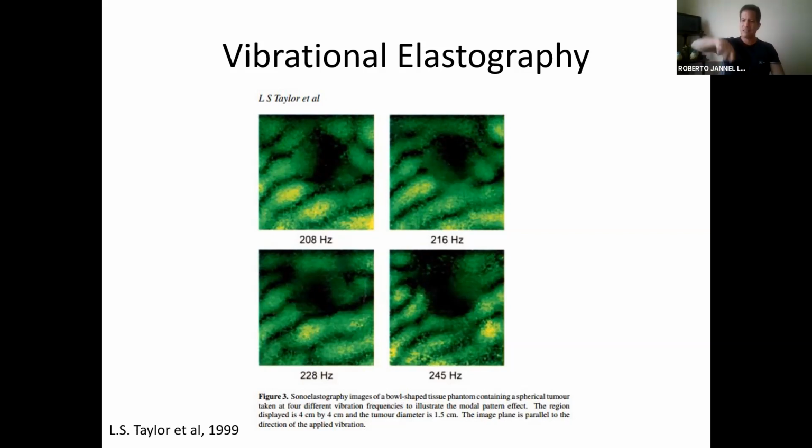If you're receiving the signal and measuring not the speed at which things are moving, because you kind of know that, but the magnitude of how much they're moving, then you can determine which tissues are stiffer and which are softer. You do that with a method called power Doppler. Again, look it up in your material. All power Doppler does is grab your data, apply wall filters to eliminate the slowly moving parts, keep only the parts that are moving, and integrate the signal, or figure out the magnitude or energy in the signal.